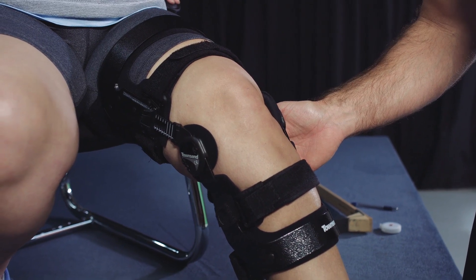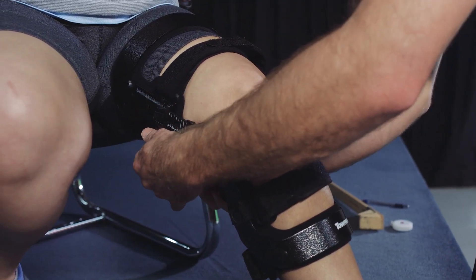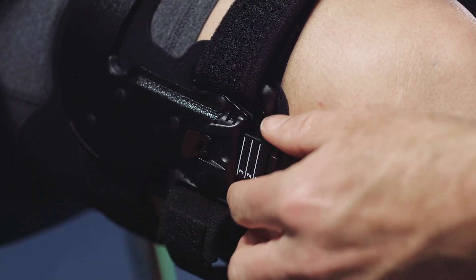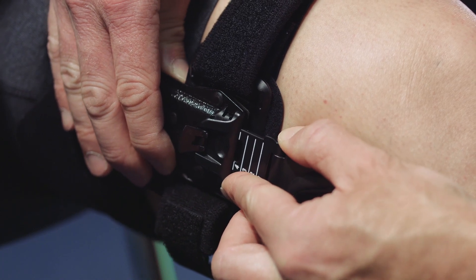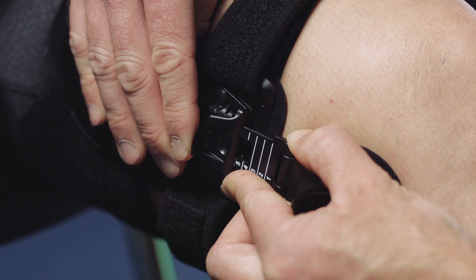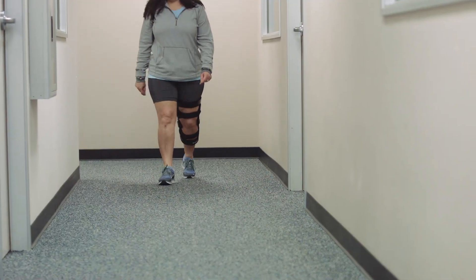Re-seat the patient at the edge of the chair with their knee flexed 60 to 90 degrees. Loosen both thigh straps, release the snap lock lever, and extend the load shifter upward one to two increments on the affected compartment while keeping the load shifter locked on the unaffected side. Re-lock the load shifter on the affected side and have the patient ambulate.